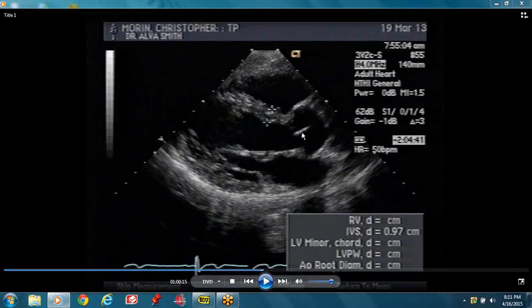The aortic valve is closed and the mitral valve is open. This would be our diastolic frame. Diastole is from the end of the T wave to the beginning of the QRS.